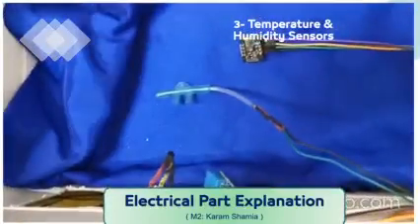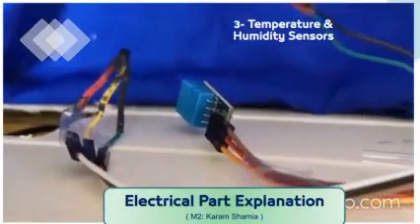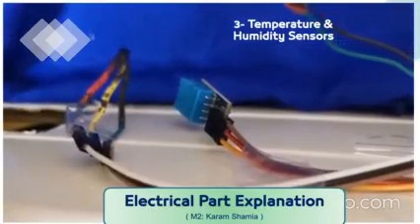then send the data to the controller to control it. If the humidity is more than 50, it will switch off the humidifier. And the temperature sensor will get data from the air temperature, then send it to the controller. So if the temperature is more than 37 Celsius, it will switch off the heater.